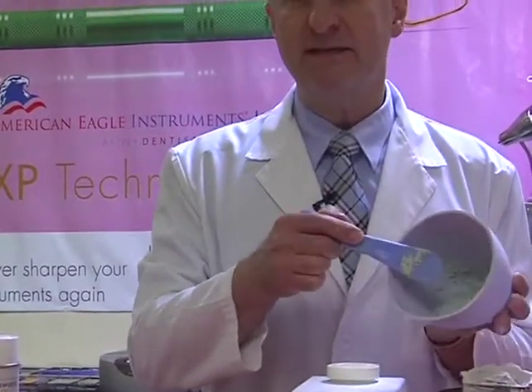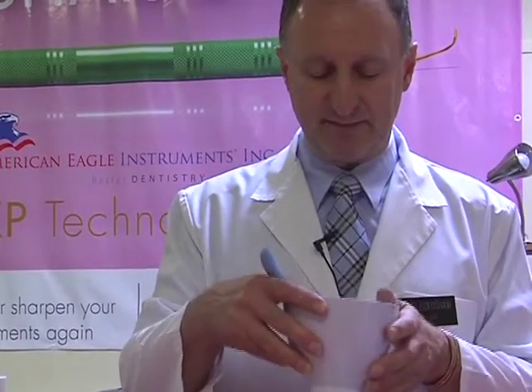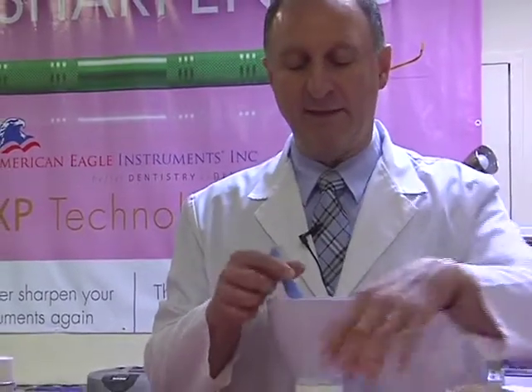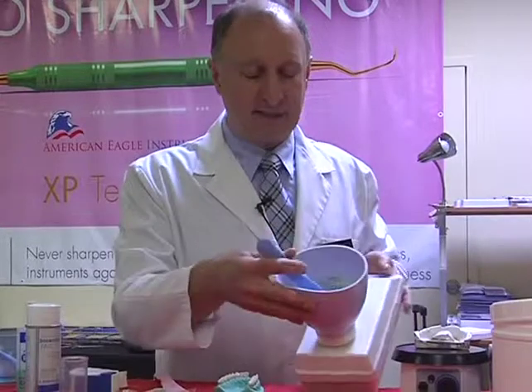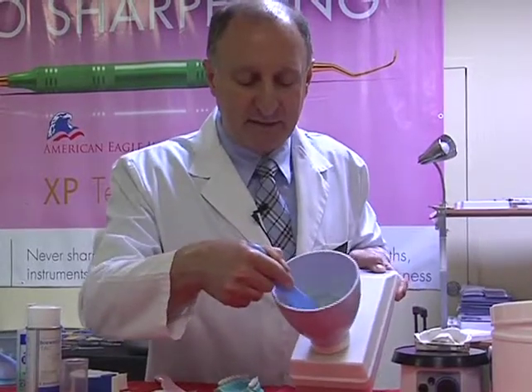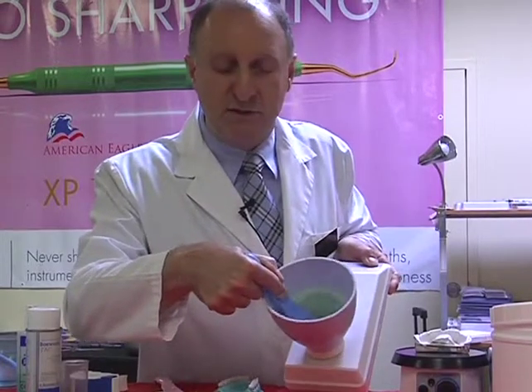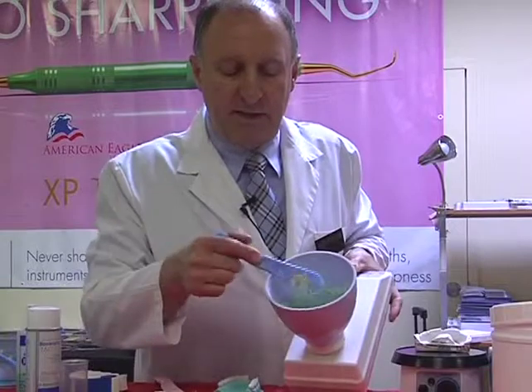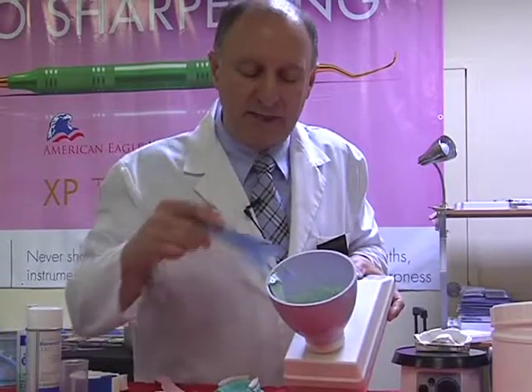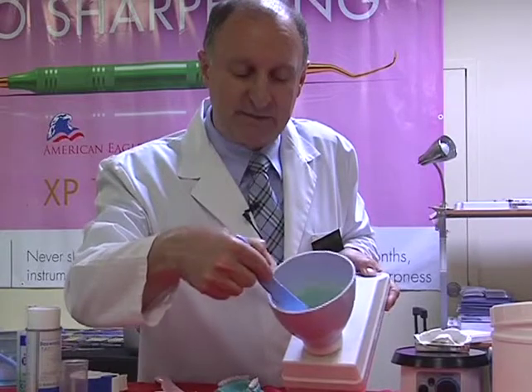Now after we've combined these two together, I'm going to put this back onto the alginator, and then I'll turn this around towards you. I'll do the same procedure that I did previously. So lightly slide this down 3 times. 1, 2, and 3 times, just making sure that everything was picked up. Drop to the bottom, and then the same thing on the high speed, the same procedure.